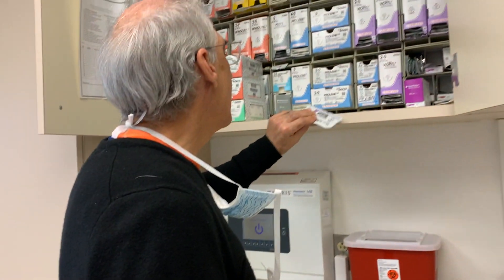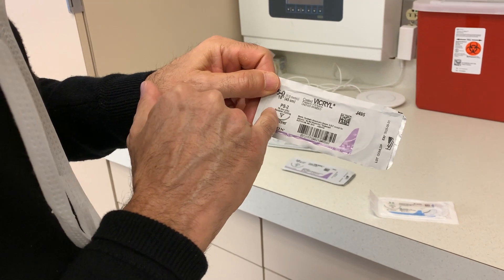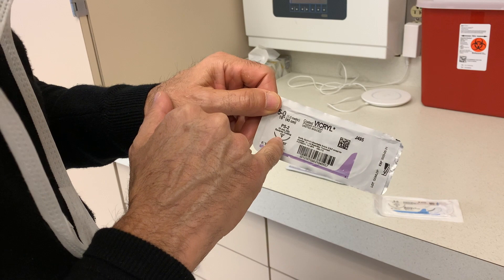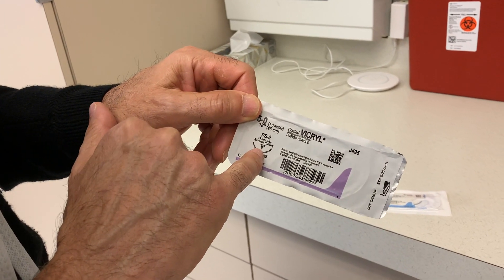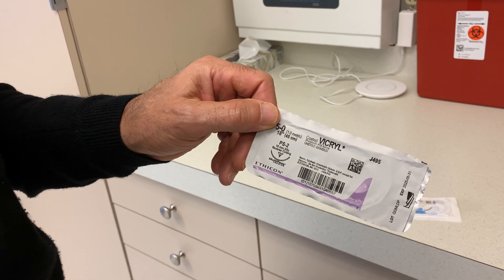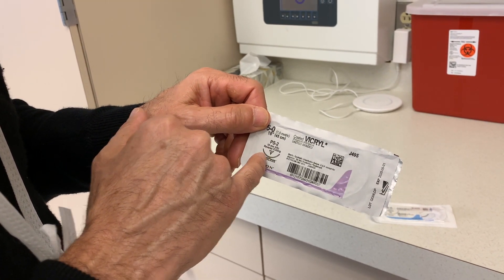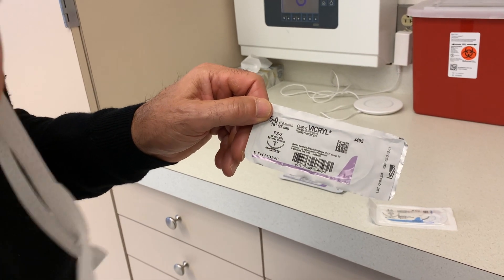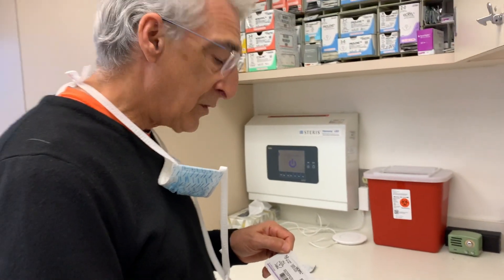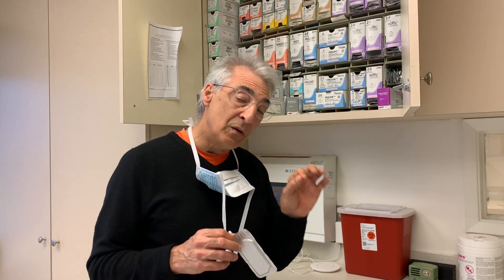Let's take a look at a cutting needle. Here is another half circle — it's got a cutting tip. Here's a cross section of the tip, and as that tip goes through the skin or whatever we're sewing, the sharpness at the tip will cause a little tiny incision and allow the rest of the needle and the suture to go through.